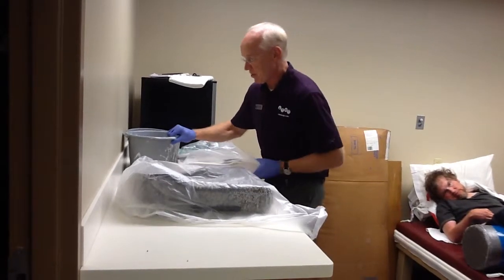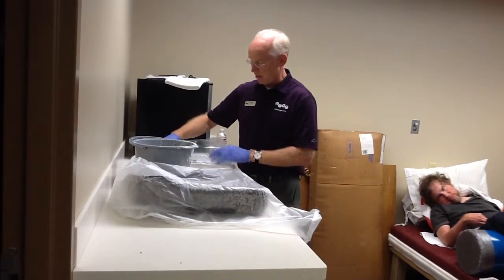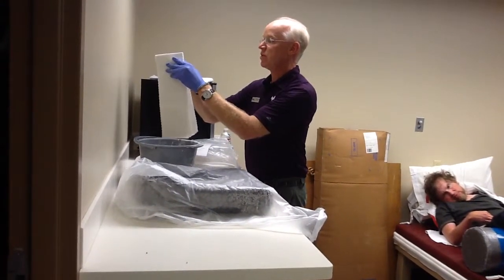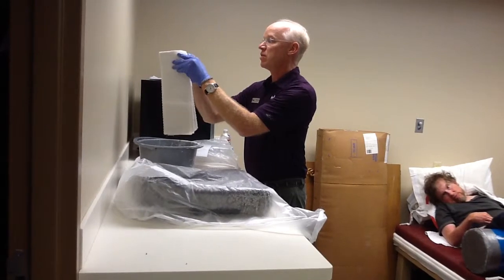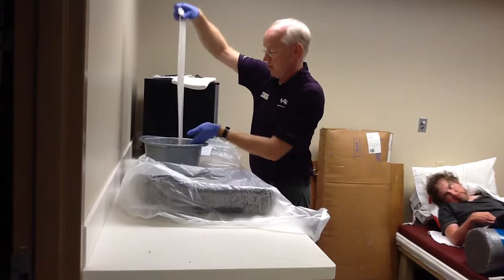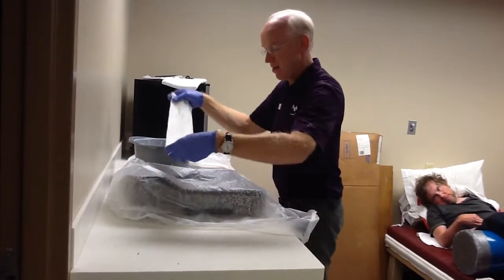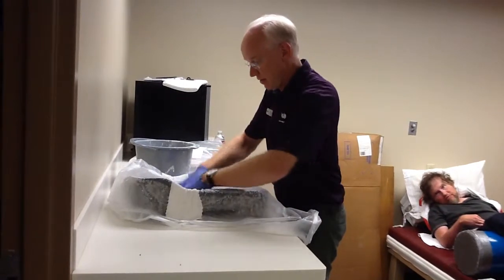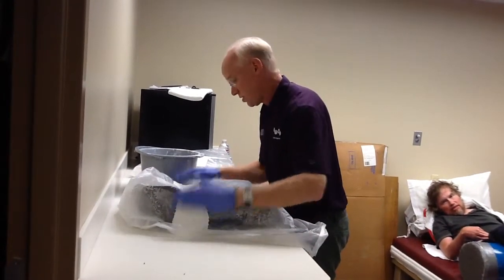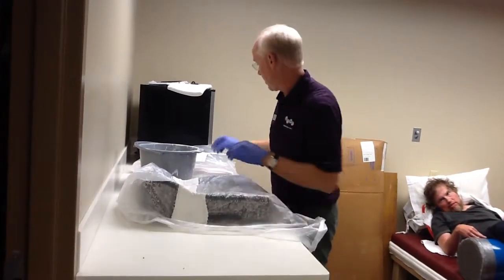I've opened up my supplier's plaster bandage kit so I can apply the bandage. We're simply going to do all five thicknesses to have a nice, strong cast. Apply it fairly wet, lay it on, get down to the table. Rub it in really well — really rub it in there.